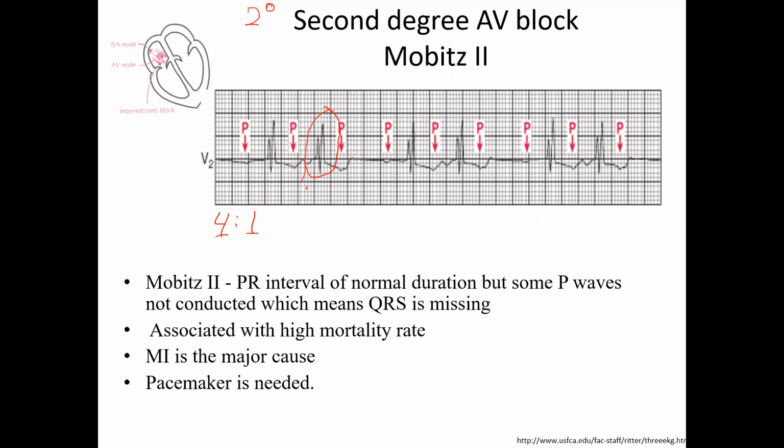Bunny ears. So this is a bundle branch block, don't you agree? On top of the AV block. And if this is V2, would it be right bundle branch block or left? Right. Way to go. Way to go.